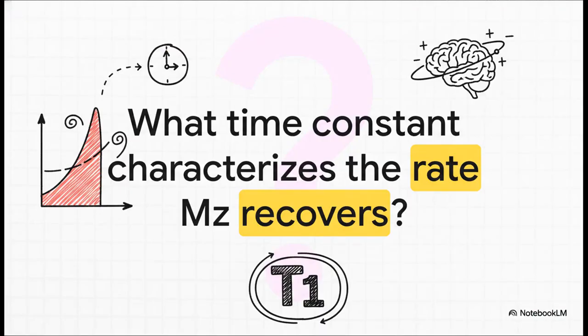So we know MZ is on the road to recovery, but how fast is it going? How do we actually quantify that rate? What's the mathematical constant that tells us how quickly it's going to get back to its full strength, back to M0? Well, the answer to that question is the T1 relaxation time.